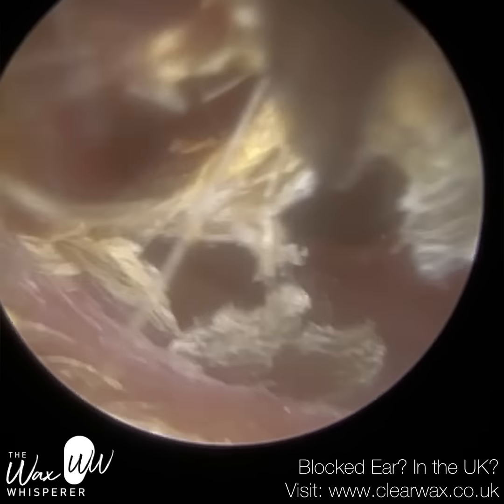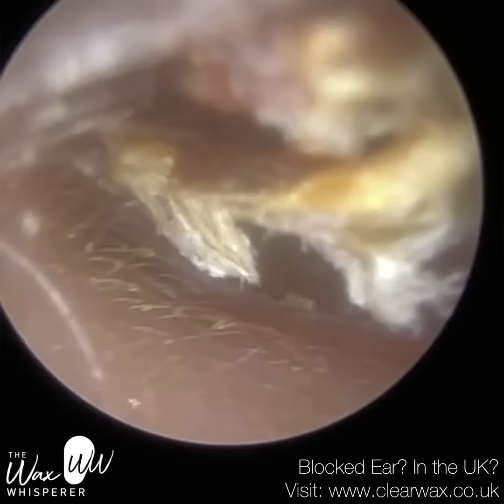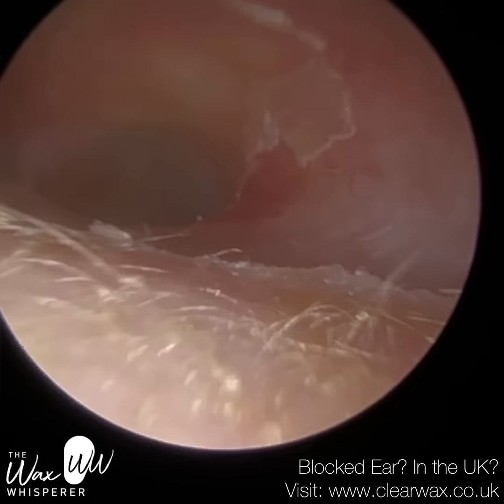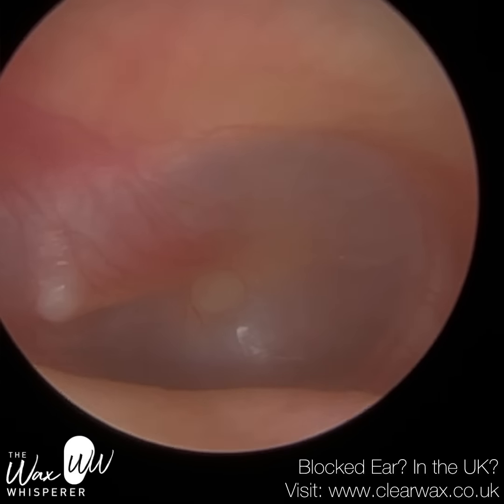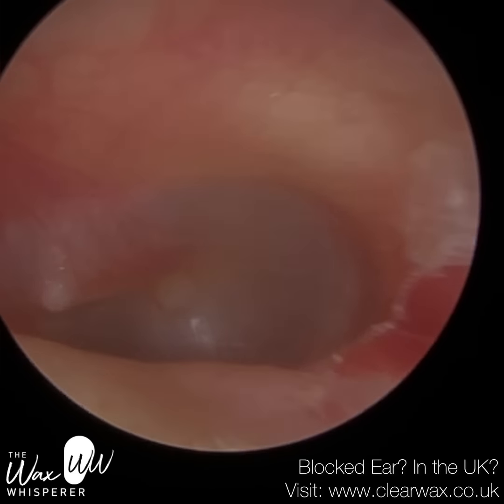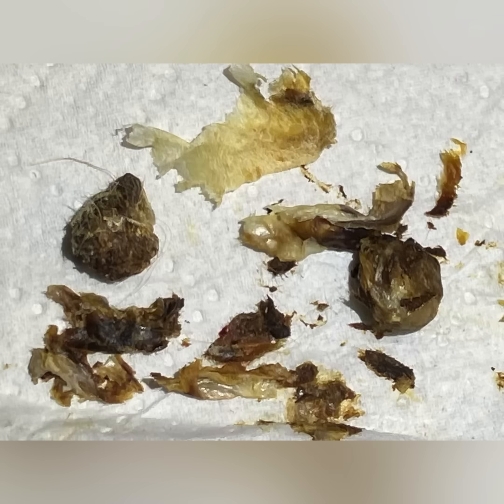So just rotated the jaws of the forceps to get the necessary grip. Just pull that away. You can see here there's no widening of the ear canal. There's no ridge. And that's the patient's eardrum. And that's the contents of both ears. As you can see, mainly it's dead skin, a bit of wax, but predominantly keratin.